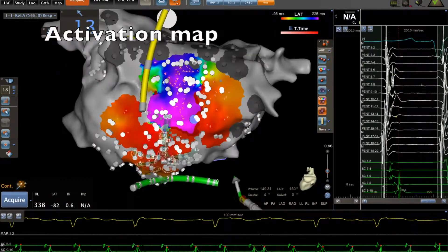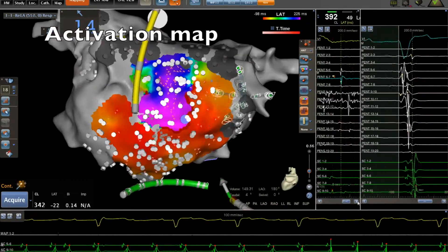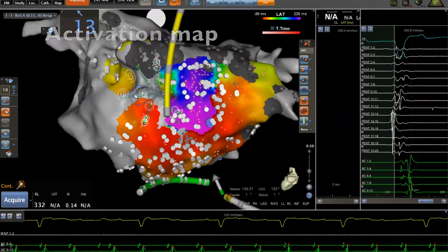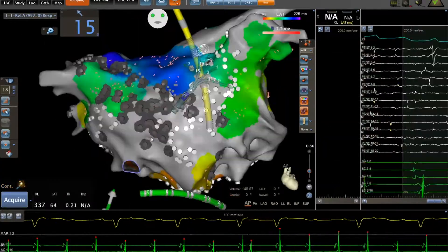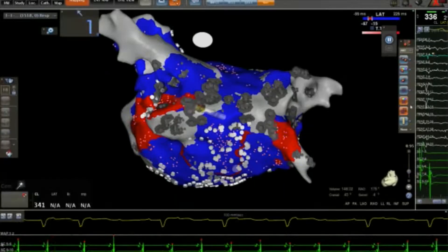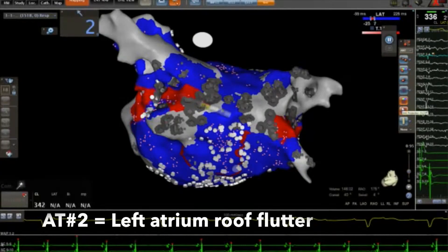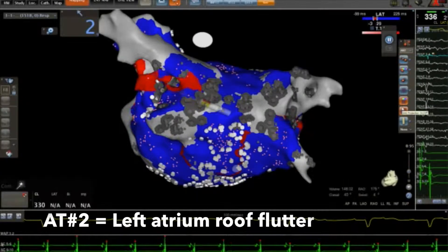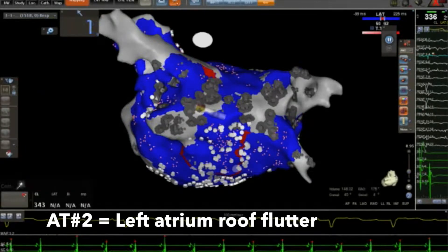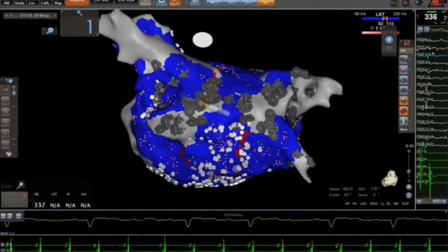The activation map was performed with the Pentaray catheter. Activation map and post-pacing intervals are consistent with a macro re-entry — a left atrium roof flutter.